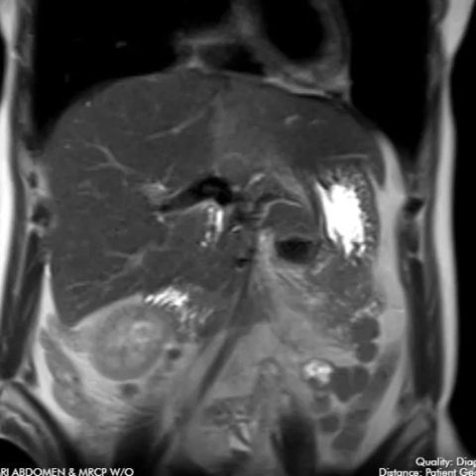And so listening to her symptoms, I decided that rather than just an MRCP, which would probably be normal if the gallbladder ultrasound was normal, it'd be a waste of her money, so I decided to do a whole abdomen, and also look at the aorta too, just in case, because some things there can cause problems with the GI system.